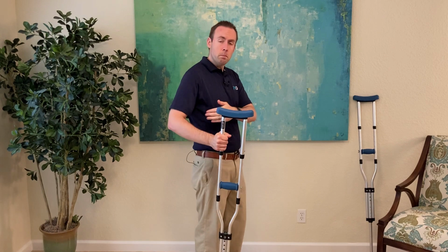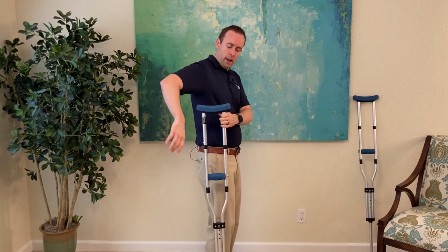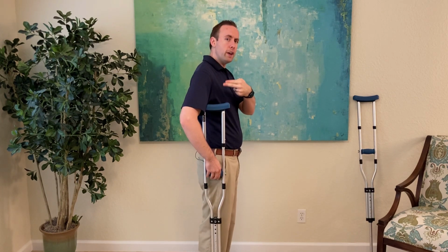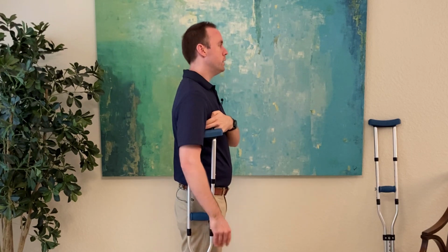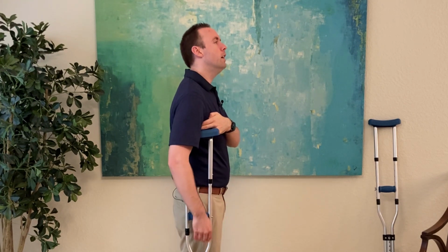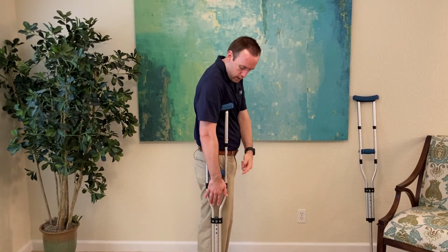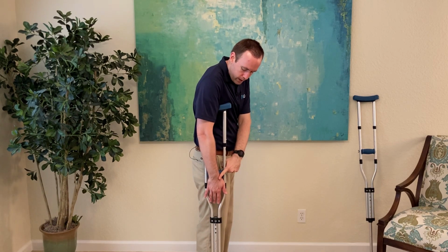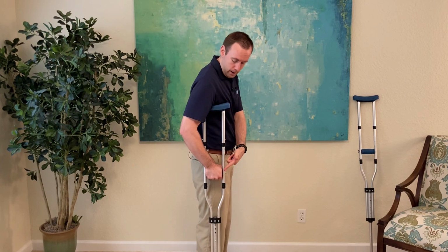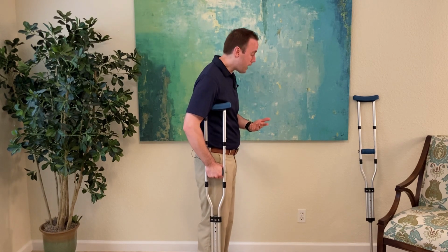They're meant to be placed alongside your ribs. So for this instance, I'm going to put it right here. I'm standing up tall, and you really want this pad to be about 2 finger widths from your armpit. So when you're standing nice and tall, mine's about there. It's about 2 finger widths, 2.5, maybe a pinky. That's looking good. And if you notice, when I drop my hand down, this handle is basically right at my wrist, so that when I grab the handle, I'm right there, and it's got a slight bend in my elbow. That's perfect. This is set to the right height for me.